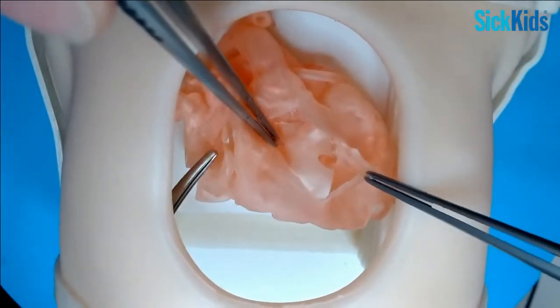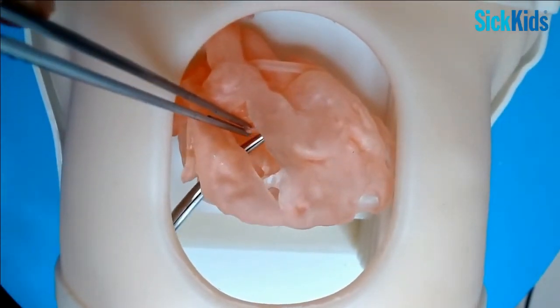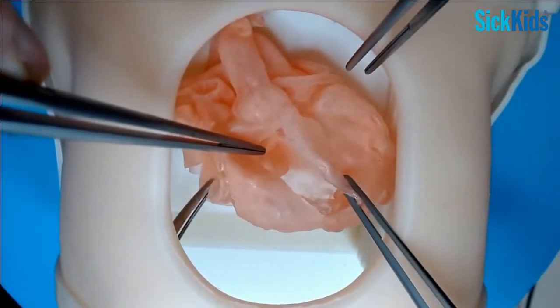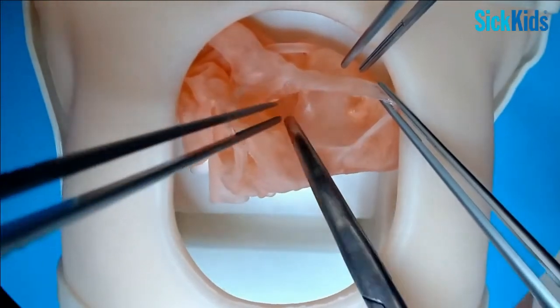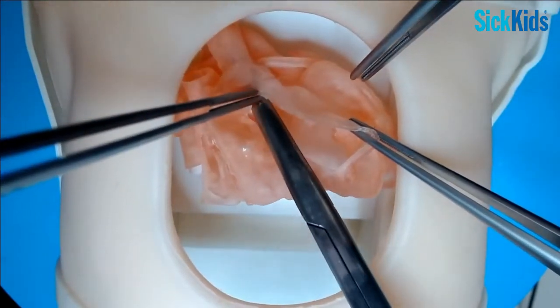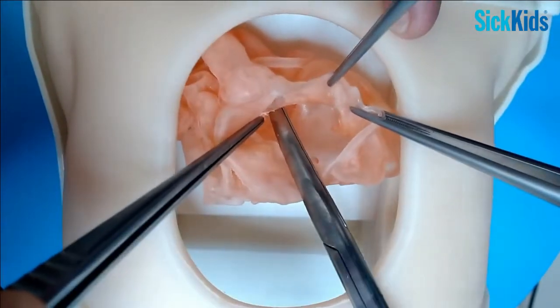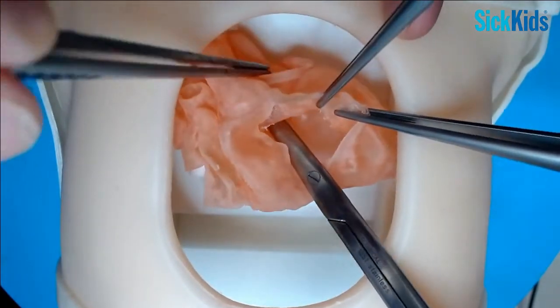You can put a probe through the tricuspid valve just to be sure you understand in your own mind where everything is. That's looking through your tricuspid valve, here's the VSD down in there. Obviously here's the aorta, very anterior - the aorta is the furthest away from the septum. And as you look up, there's the pulmonary valve.